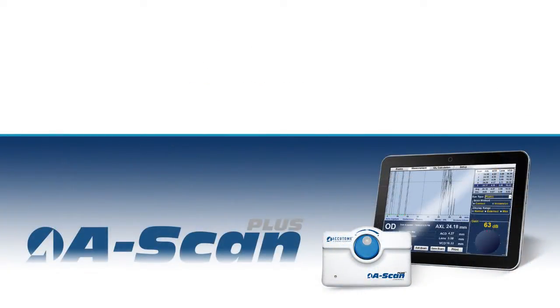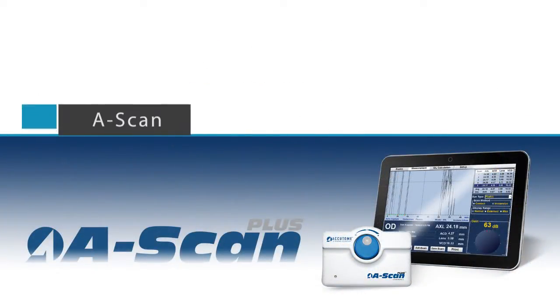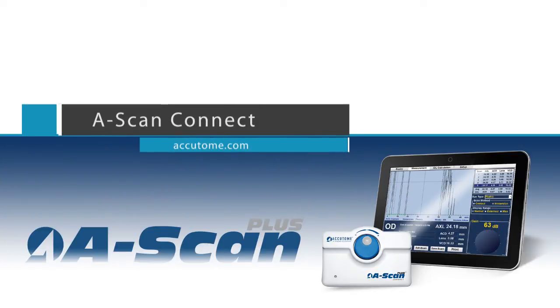This video will demonstrate the proper setup and technique for operating the Accutome ASCAN Connect.